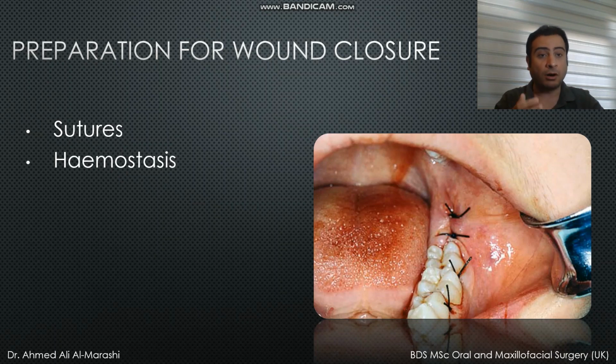If there is obvious bleeding, I would manage it. Sometimes we need to place more sutures, sometimes the sutures are loose, and we need to cut them and place another suture. Sometimes we have blood vessels that have been cut, especially if it is a long releasing incision, and we need to manage that too. So we need to make sure that hemostasis has been achieved. Sometimes patients are on antithrombotic medications, for example aspirin or warfarin, and we need to take extra caution with those patients. We need to make sure that bleeding has stopped before the patient leaves the dental office.